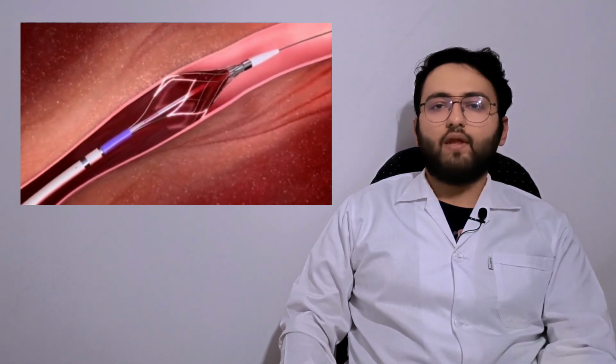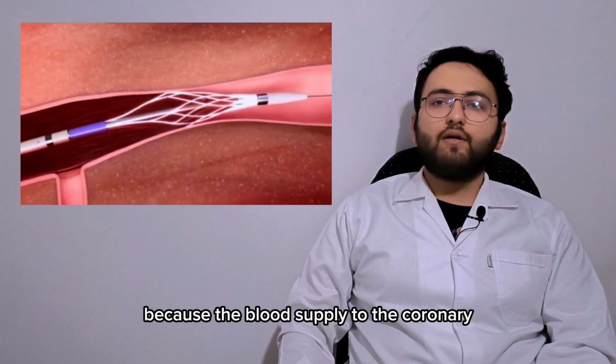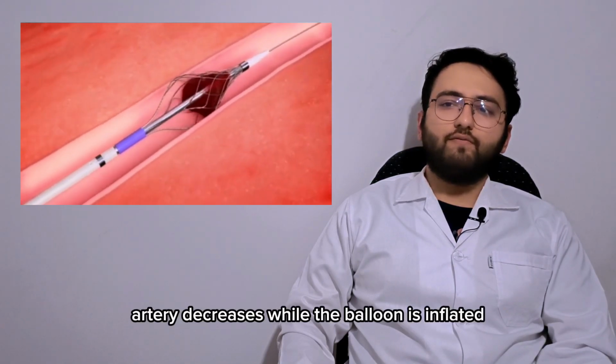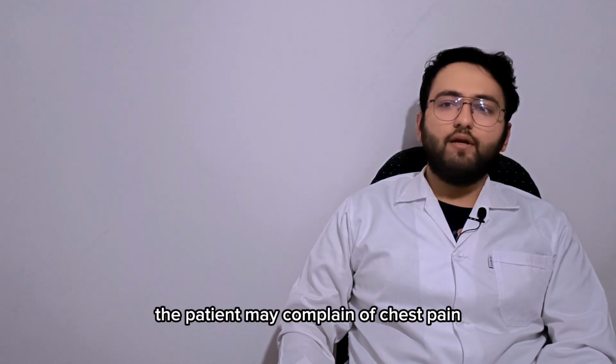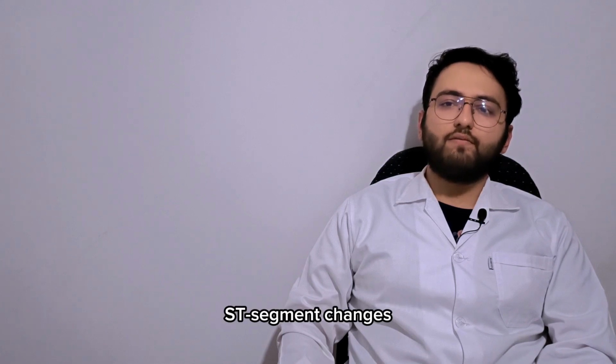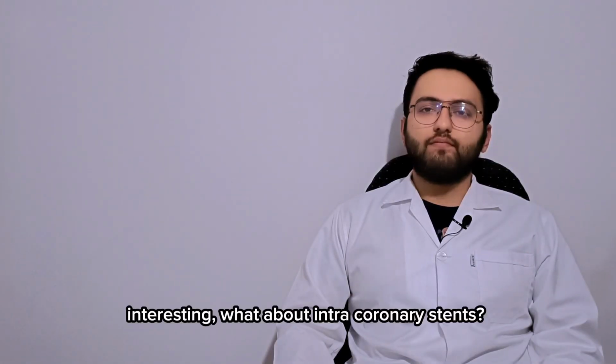is withdrawn. During this process, because the blood supply to the coronary artery decreases while the balloon is inflated, the patient may complain of chest pain and the ECG may display ST segment changes. Interesting. What about intracoronary stents?